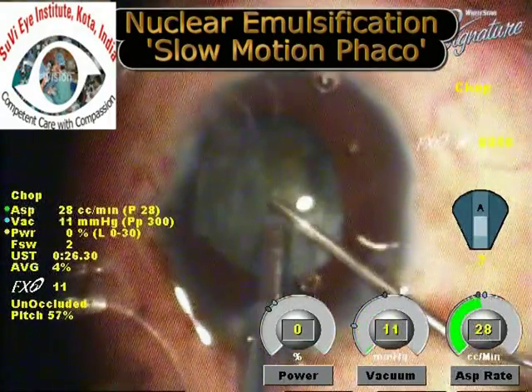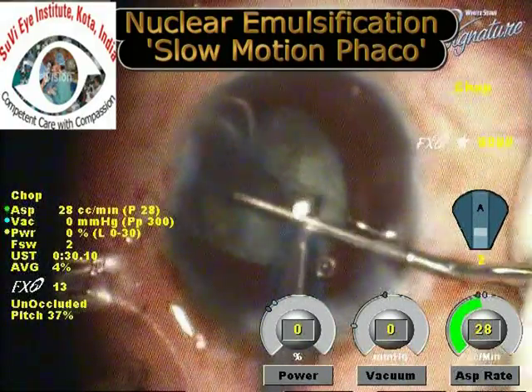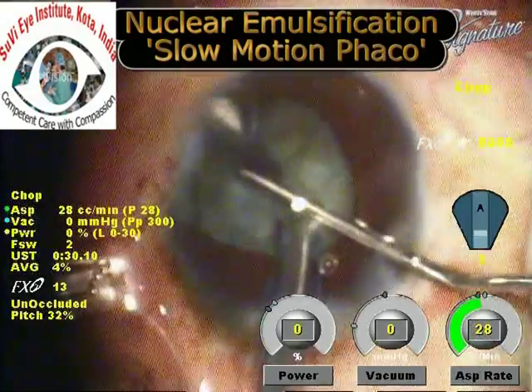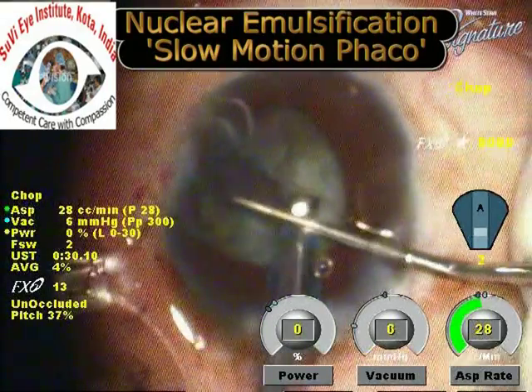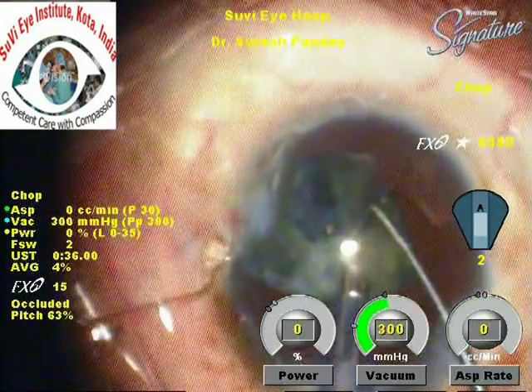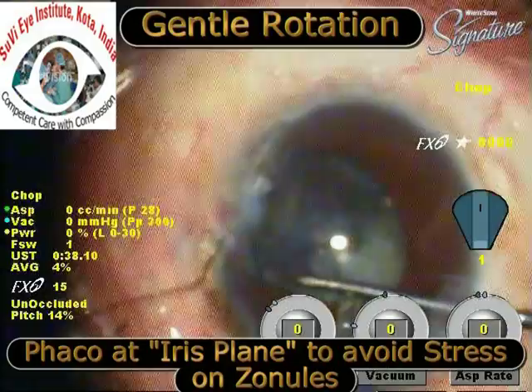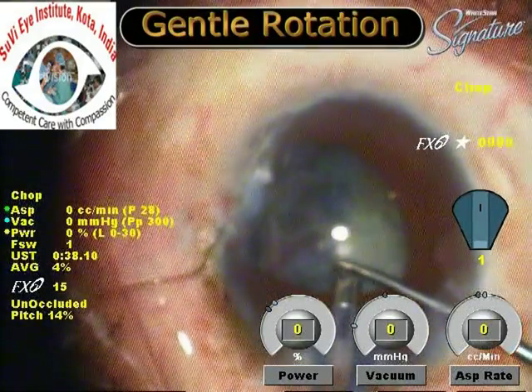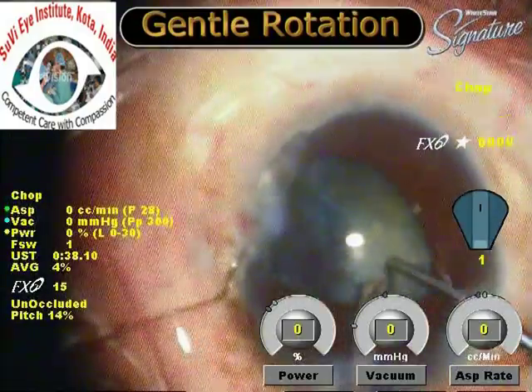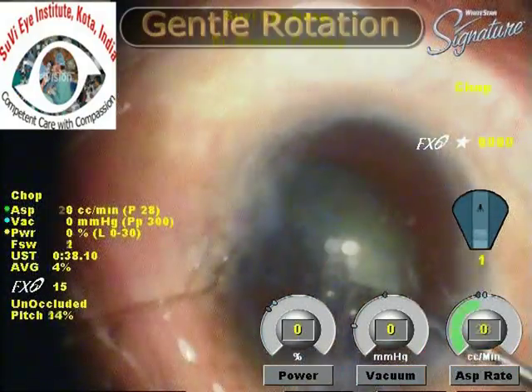We then perform slow-motion phacoemulsification using an LF AMO Signature machine. This phacoemulsification must be a slow-motion technique with minimal turbulence and low parameters so that there is minimal damage to the zonular complex and no further injury to the already compromised zonules. It is a good idea to perform phacoemulsification at the iris plane to avoid further stress to the zonules.